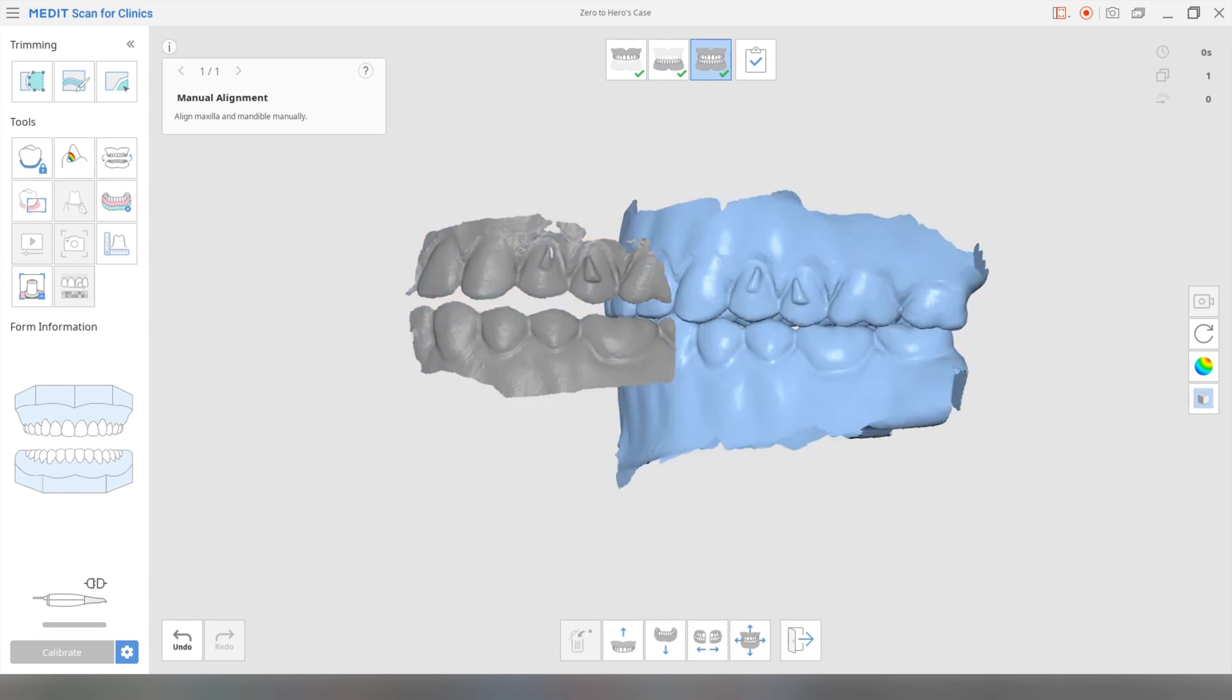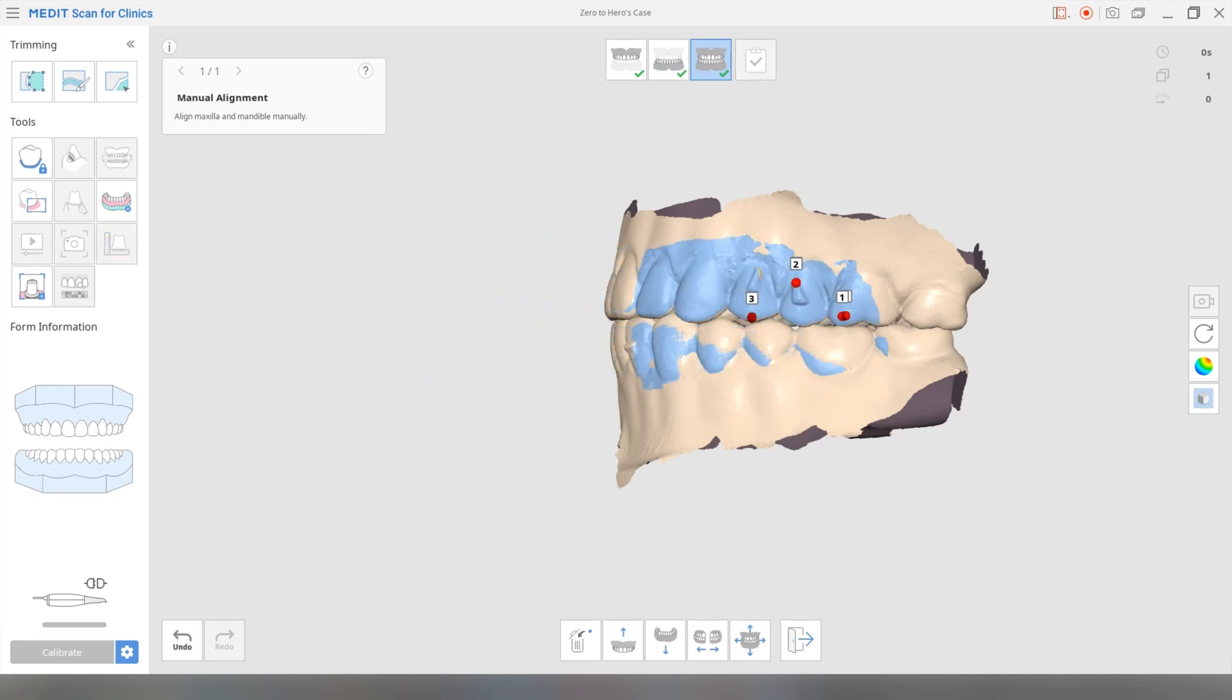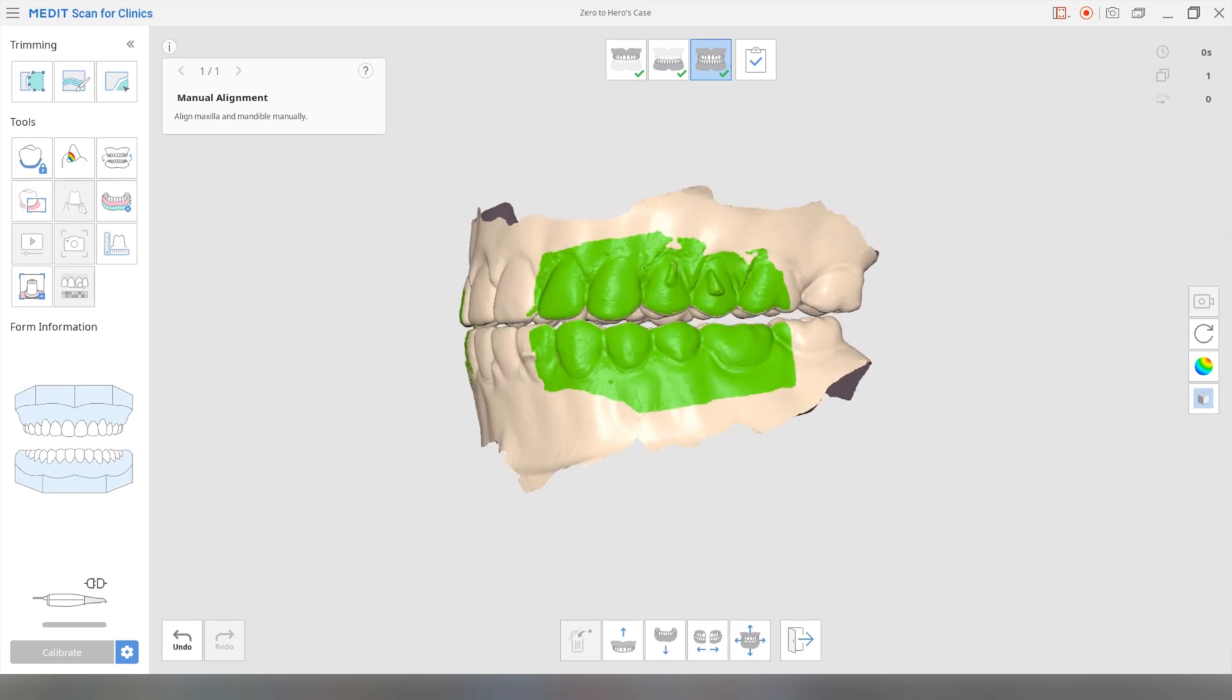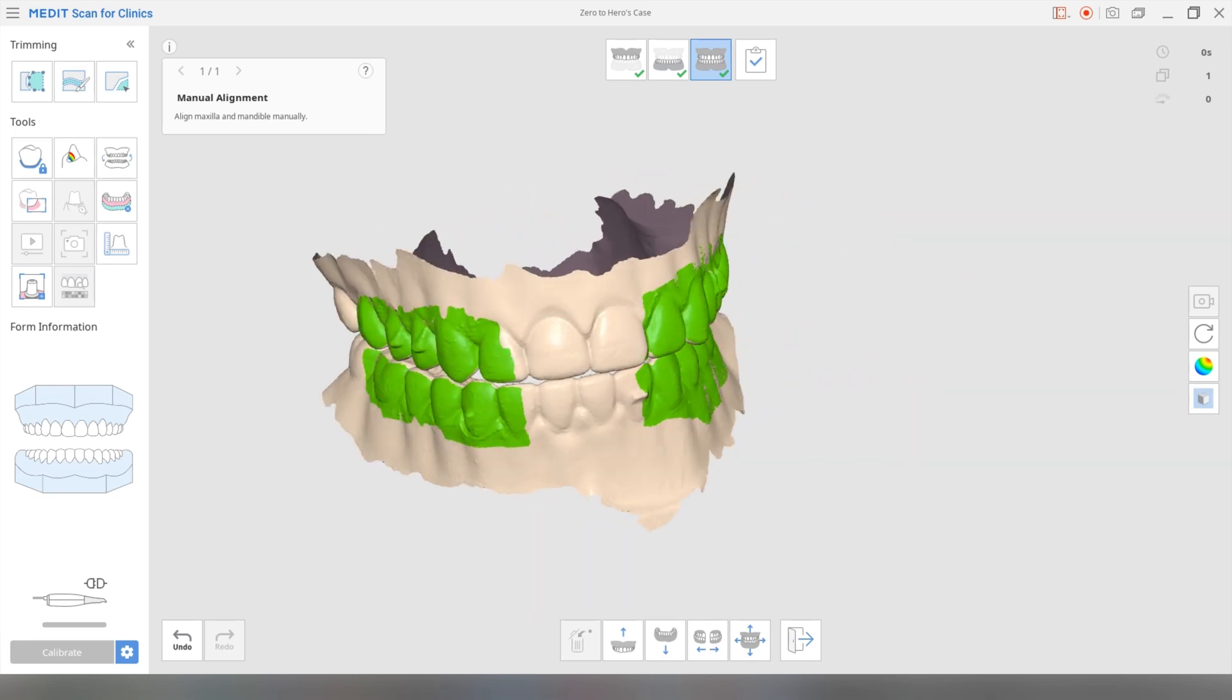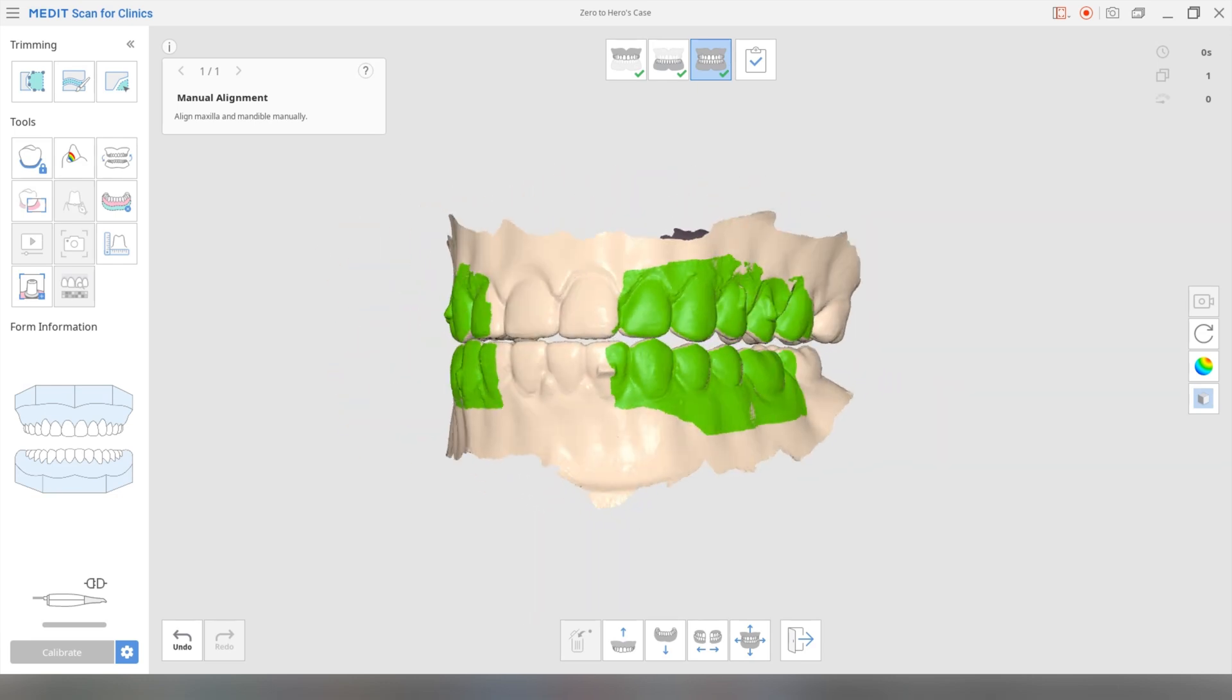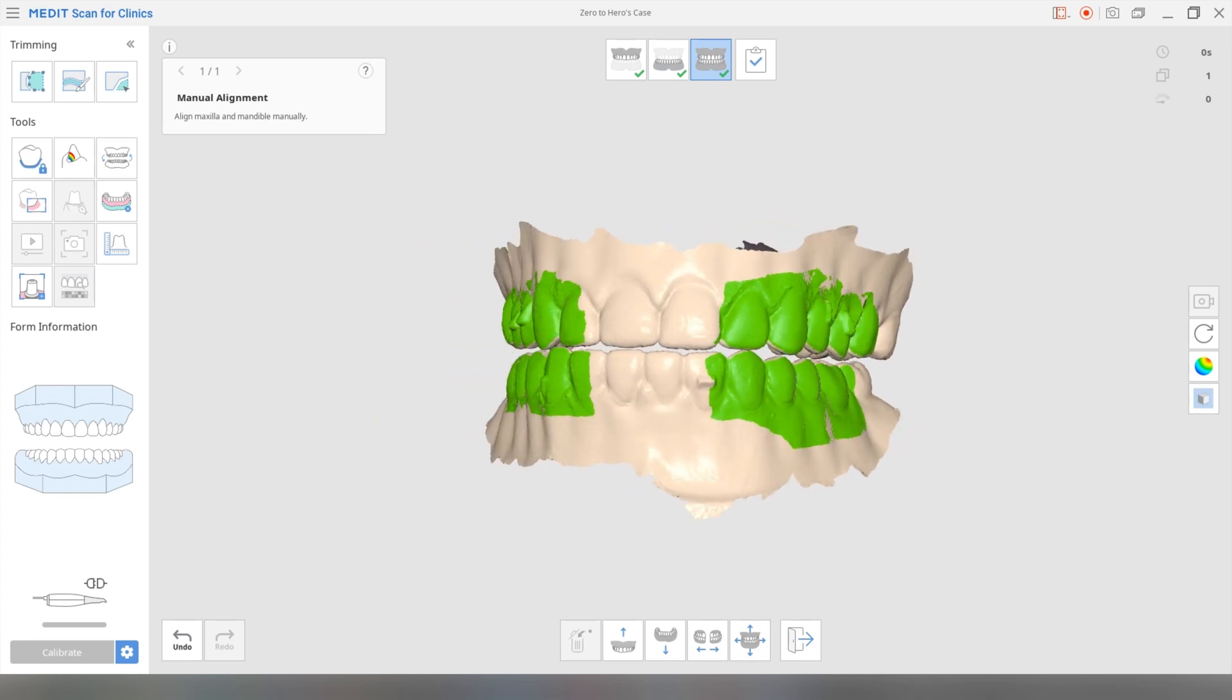And we're going to manual realign. Just move that over here so I can see a bit better. Okay. So once again, I'm going to click one. Maybe I'll go for two at the tip here. And then three. Okay. Then you do the same, one, two, three. And that's it. And I really feel that that's quite fine. And then there you go. So everything's nicely aligned.